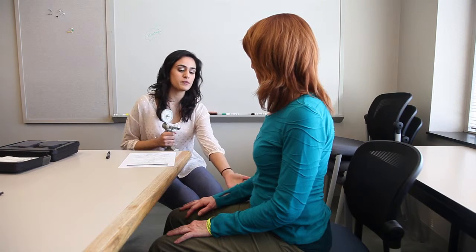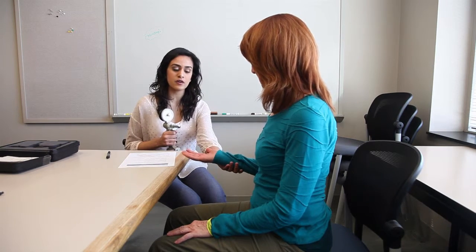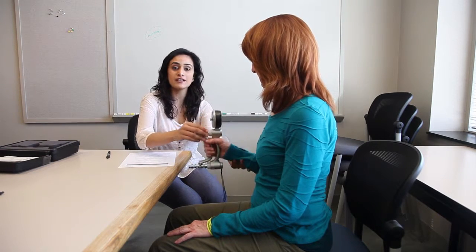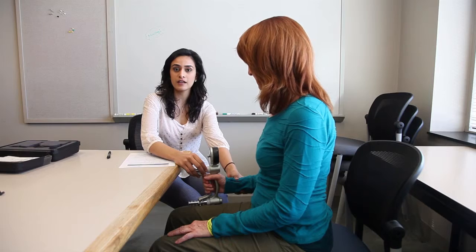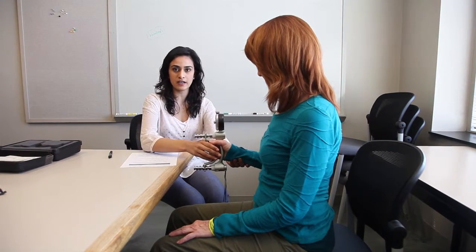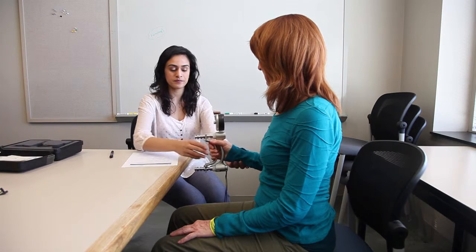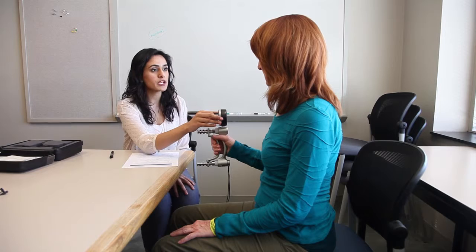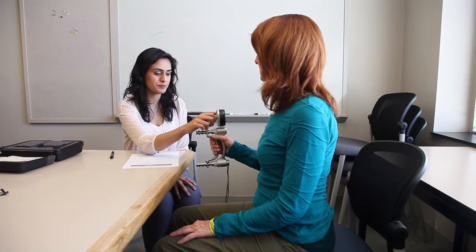You want to ensure that your patient's arm is at a 90-degree angle when they're holding the dynamometer. The patient cannot rest the dynamometer onto their leg or hold it up in the air. It must remain at a 90-degree angle with the patient's body. So we're going to perform the test. And if at any point you feel pain or you feel that you do not want to proceed with the test, please do let me know.